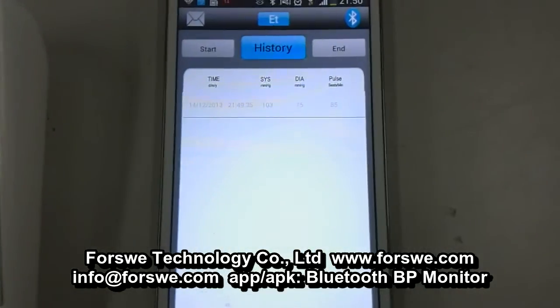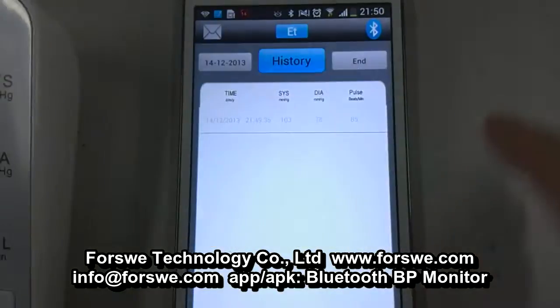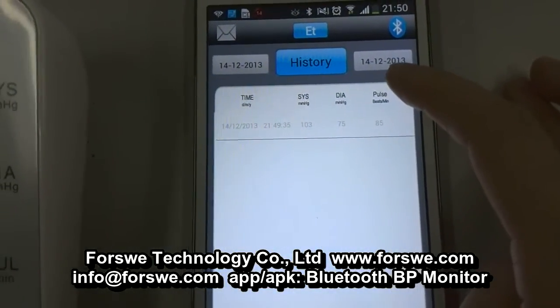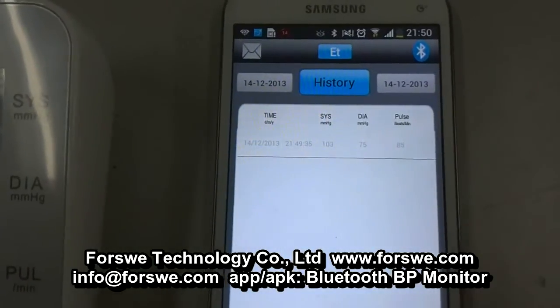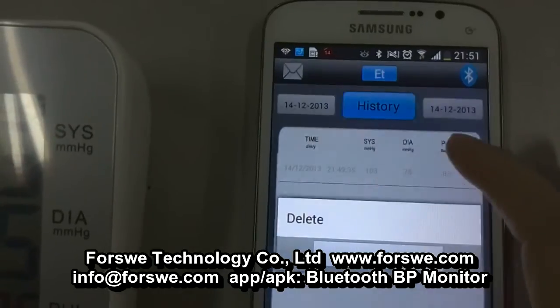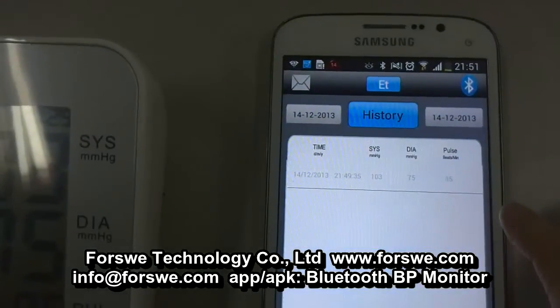In the history page you can select records by choosing a starting day and an ending day. After selecting, you can send the records to your doctors or family by email. Also, if you want to delete records, just press the record and then choose the delete button. Finish.